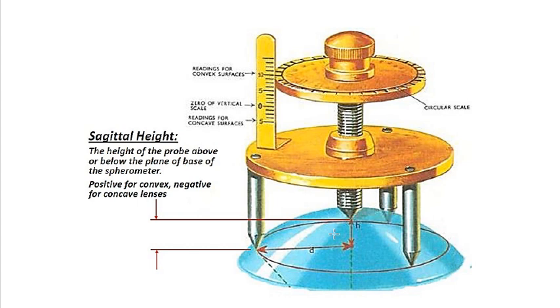We give positive for convex and negative for the concave lens because we're going with this vertical measurement. Everything below the 0 is for concave, so therefore negative for concave and positive for convex, because everything is above that 0. So they are relatively corresponding.